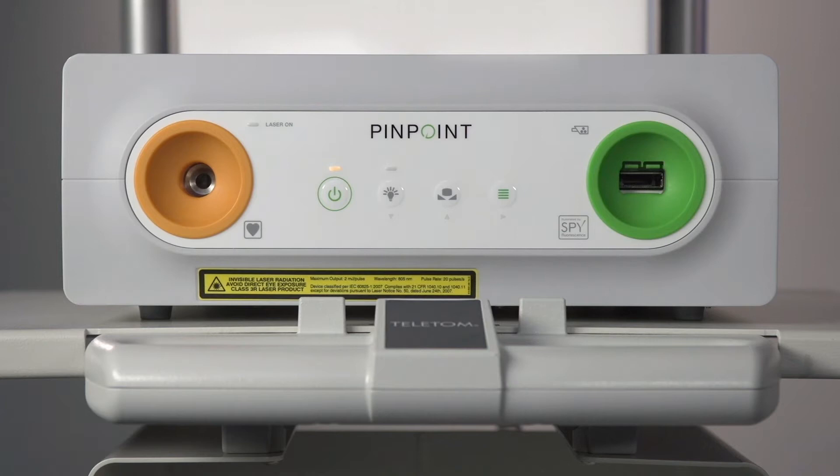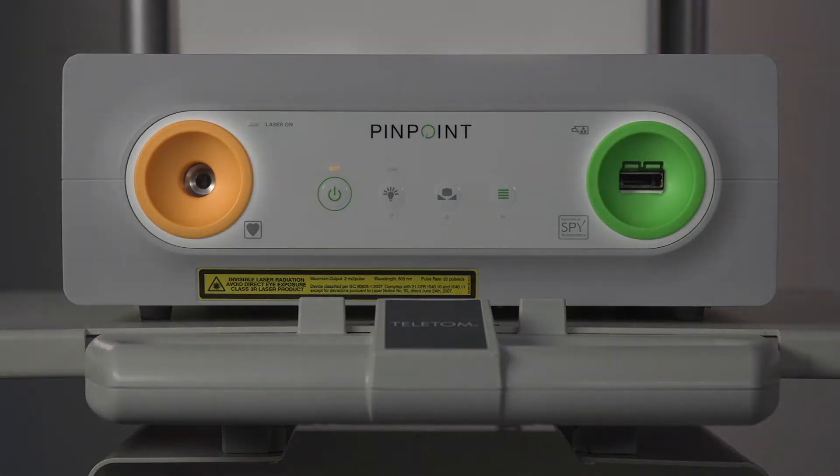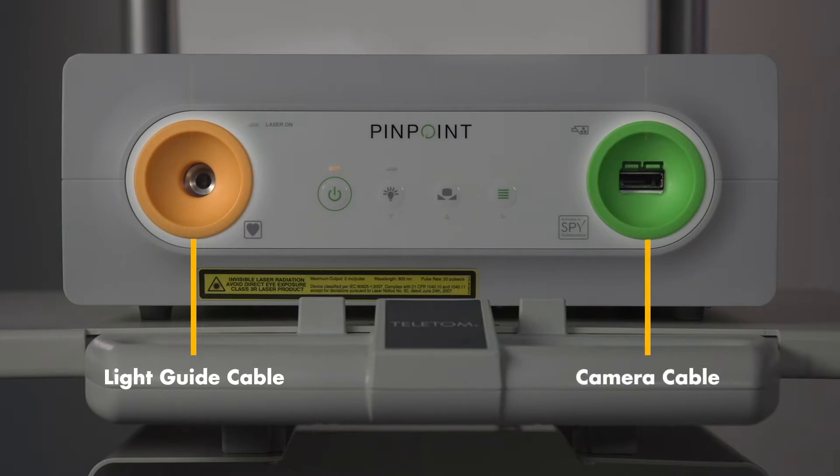Here is the front panel of the VPI. There are two ports. The orange one is for the light guide cable and the green one is for the camera cable.